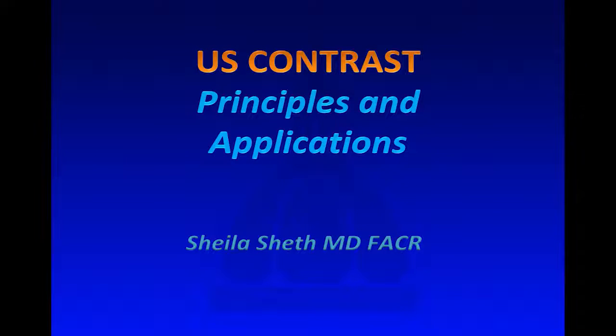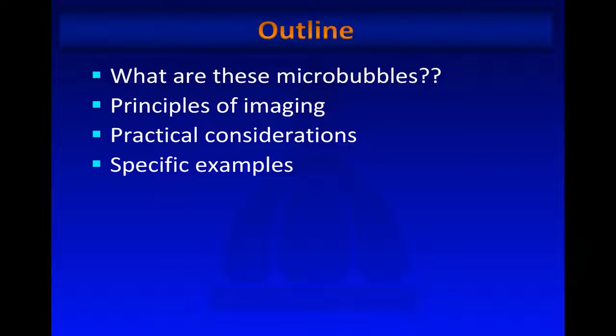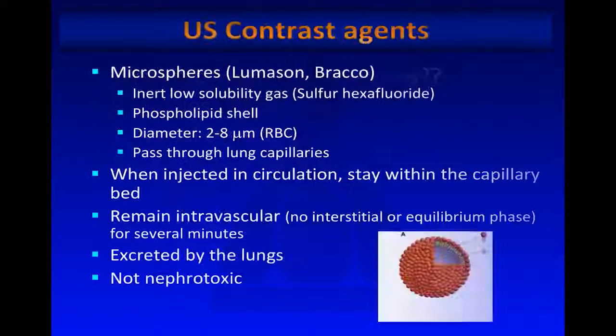Hello, this is Sheila Sheth, and today I'm going to talk about ultrasound contrast principles and applications. We'll talk about what these microbubbles are that we use for ultrasound contrast, the principles of imaging, some practical considerations, and then we'll spend some time looking at specific indications and examples.